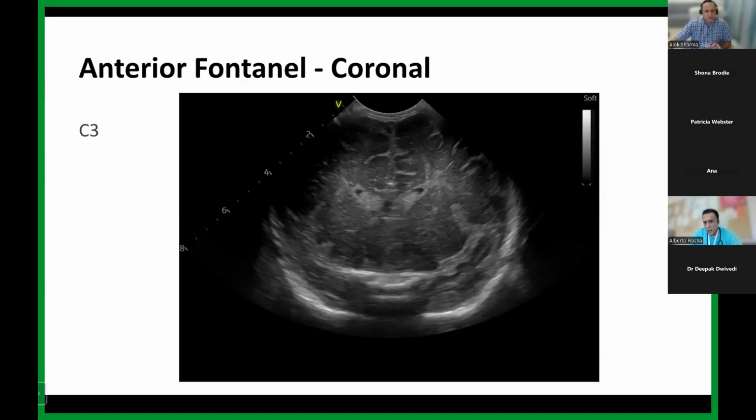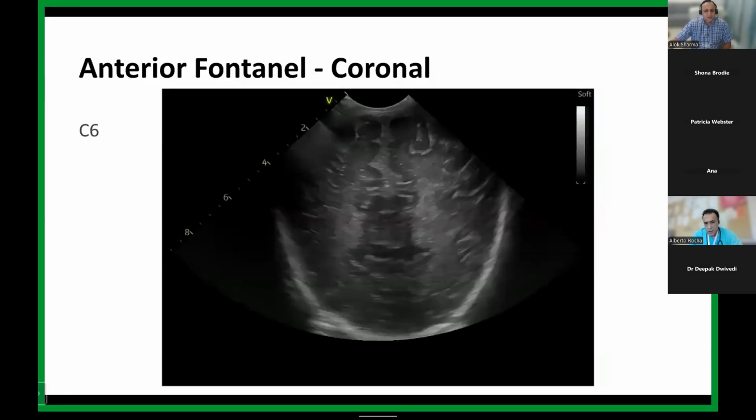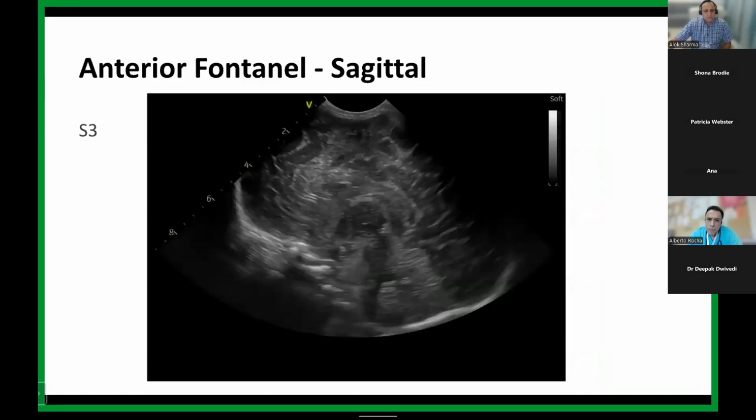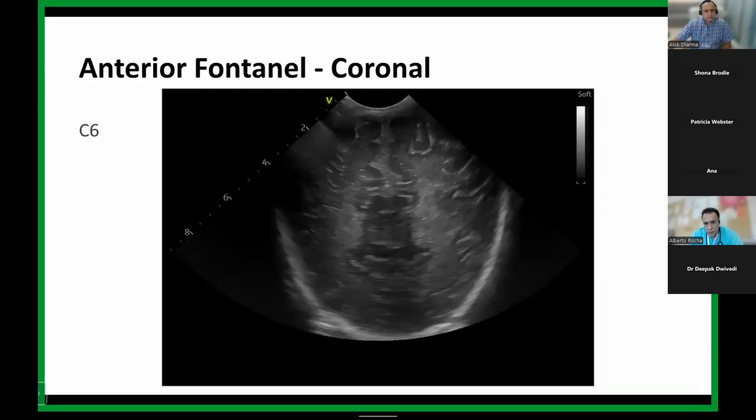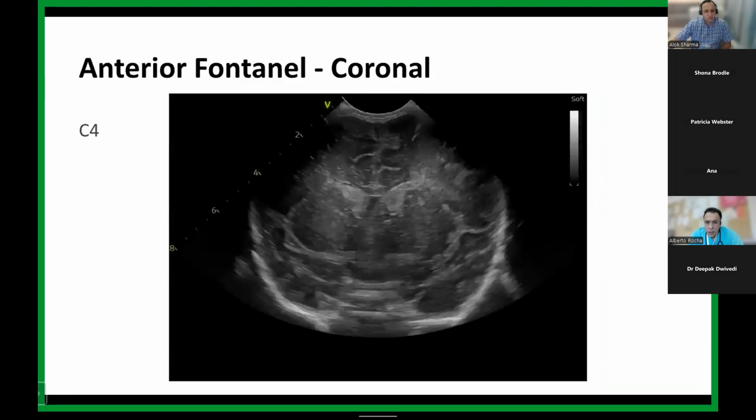The only other thing I would say is your Sylvian fissure on this side looks quite thick. Can we go to your midline image? I'm keen to explore whether there's any element of asymmetry in the Sylvian fissures. The coronal midline, this one? Yes. My gut feeling is, with the eye of faith, the Sylvian fissure looks a little bit thicker on that left side, but I'd say it's not very significant. But there's definitely flare on that left side and echogenicity that you can see in the parenchyma.